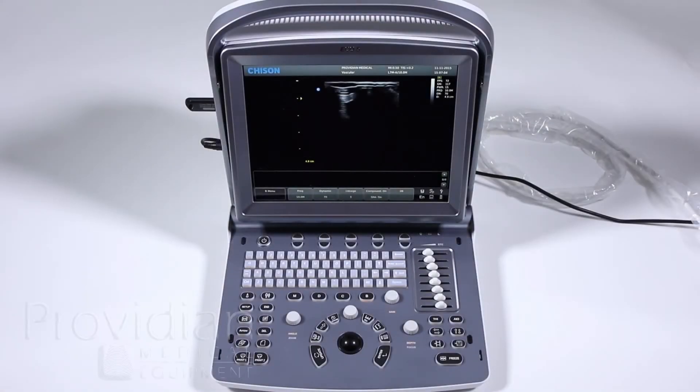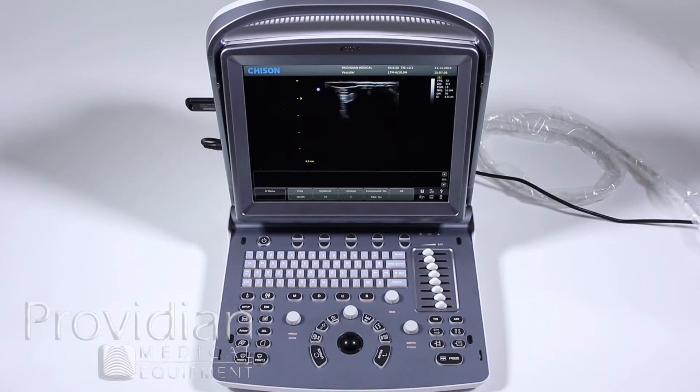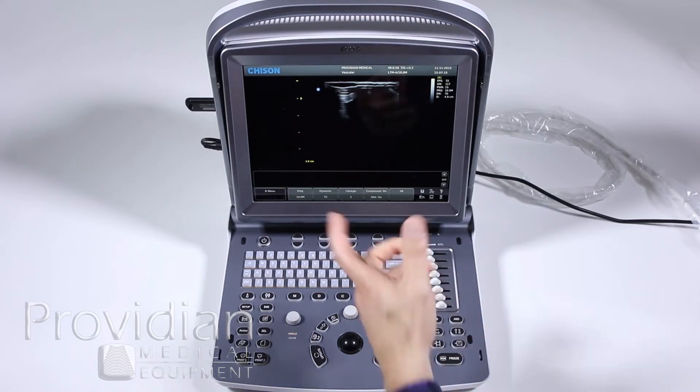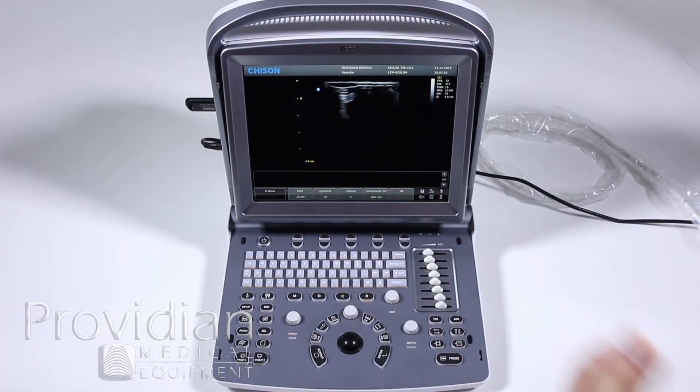Before we get into the full system setup, I did discuss saving a custom user preset. When you're more familiar with the machine and you've made some imaging adjustments, say to the dynamic range, you find yourself doing the same thing over and over to optimize the image.